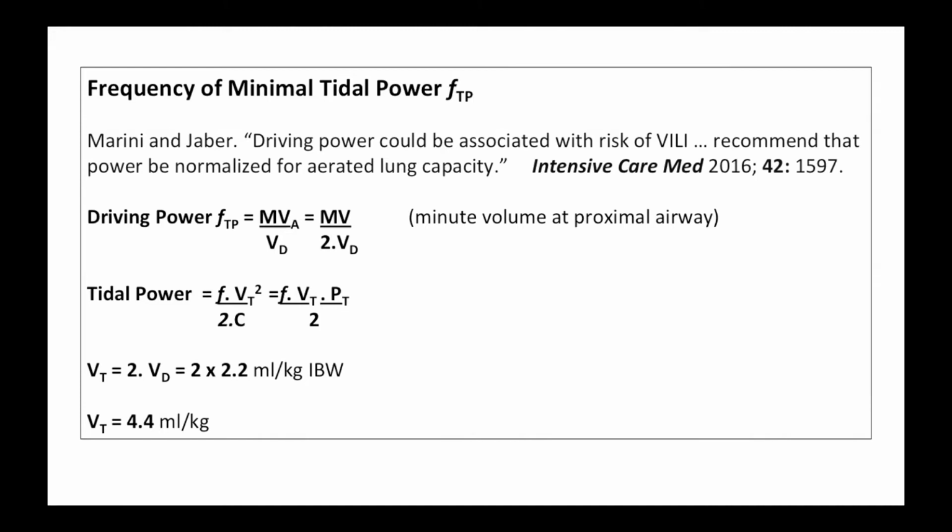And it's again possible, using the above equations on driving power and tidal power, to derive an estimate of the tidal volume, and using that estimate based on the dead space to arrive at somewhere around 4.4 mL per kilogram. So this is something that we could have a conversation about. Is it right to go in this direction in our future planning?